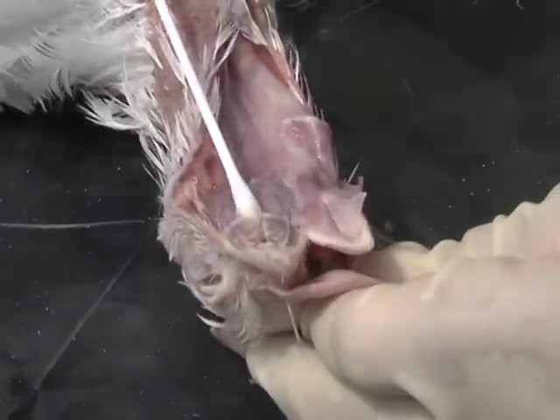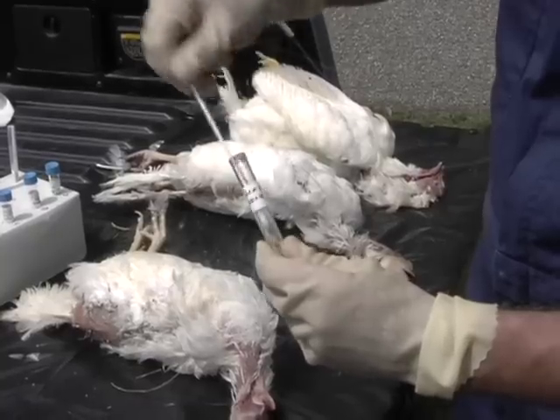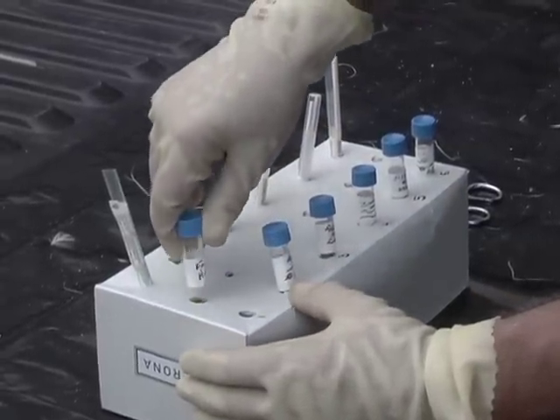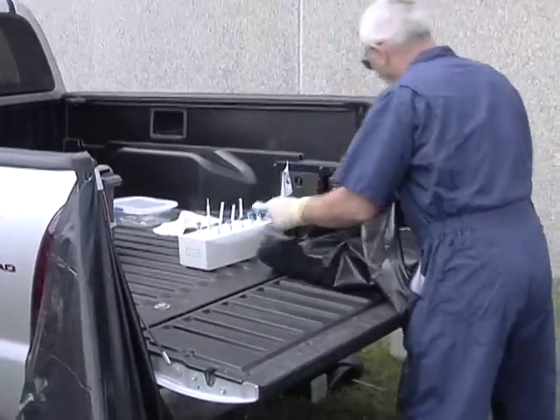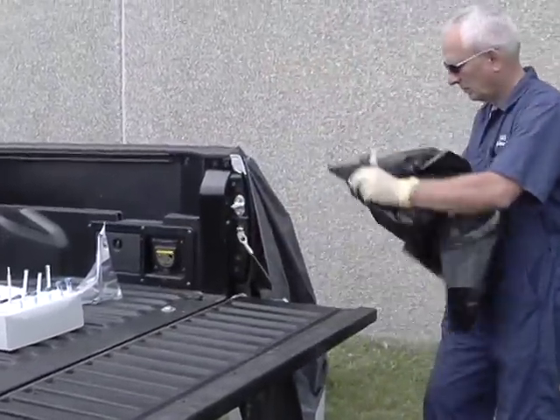When all five chickens are done and the swabs have been swirled in the BHI broth tube for house number one, tighten the cap and put the tube in the second row of the cardboard tube holder, indicating it is finished. Place your dirty scissors in a bag and discard the plastic bag covering the work area into the trash bag on the right. You will also discard your gloves.